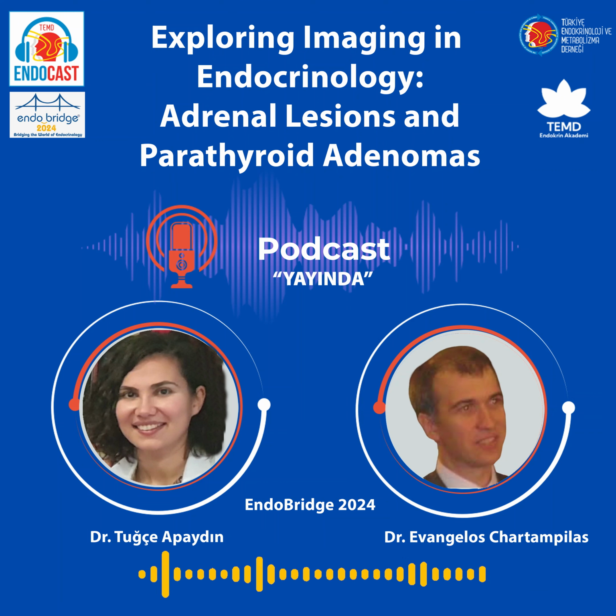In 4D CT, the fourth dimension is time. So you perform one phase pre-contrast, one post-contrast arterial phase, and one delayed phase, 70 to 80 seconds after the contrast injection, so this is the portal vein phase. Adenomas typically enhance more brightly than thyroid and then become iso- or hypodense to thyroid, or they may enhance similarly to the thyroid but then wash out. So they are hypodense on the delayed phase.